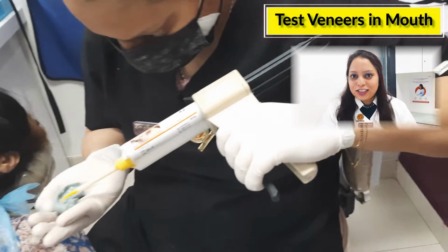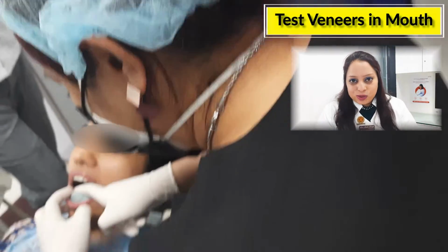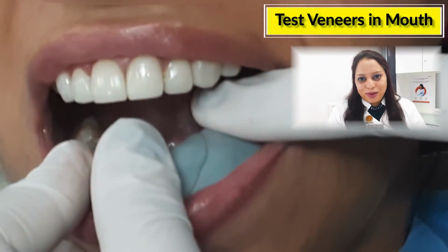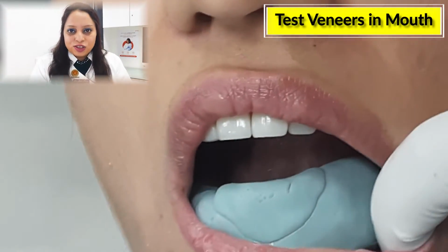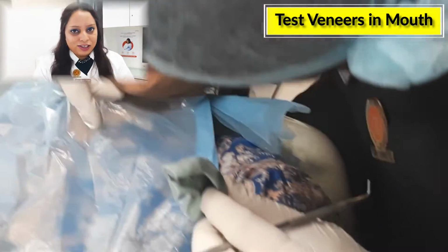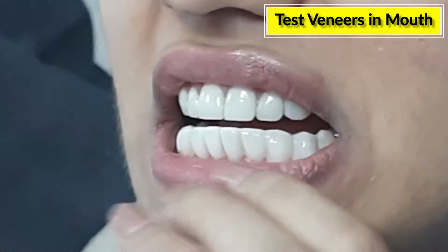After you have visualized and approved the wax mock-up, we create trial veneers in your mouth. What you see here is a temporary veneer material being used in a putty index to create trial veneers in the mouth. This trial veneers step is very important. One, the patient can visualize the final smile. Two, it acts as a reference point to control the shaping or contouring that we have to do for the final veneers. It also helps in limiting and restricting the shaping so that we are not over preparing and over trimming.